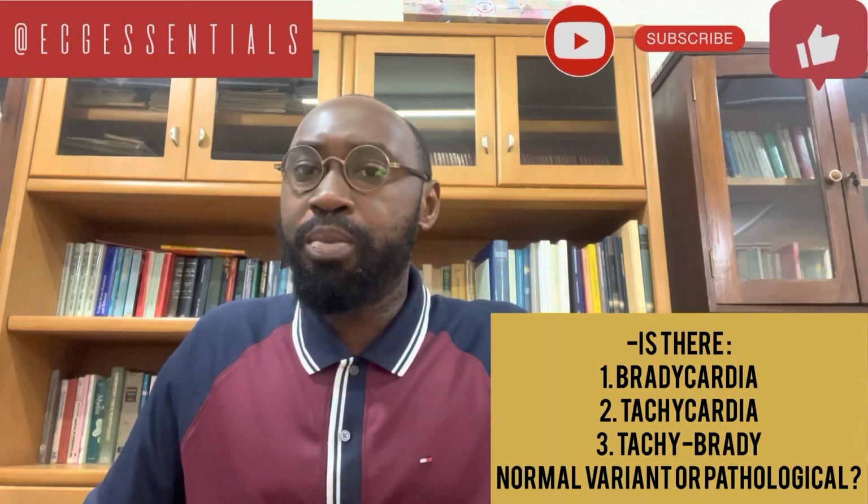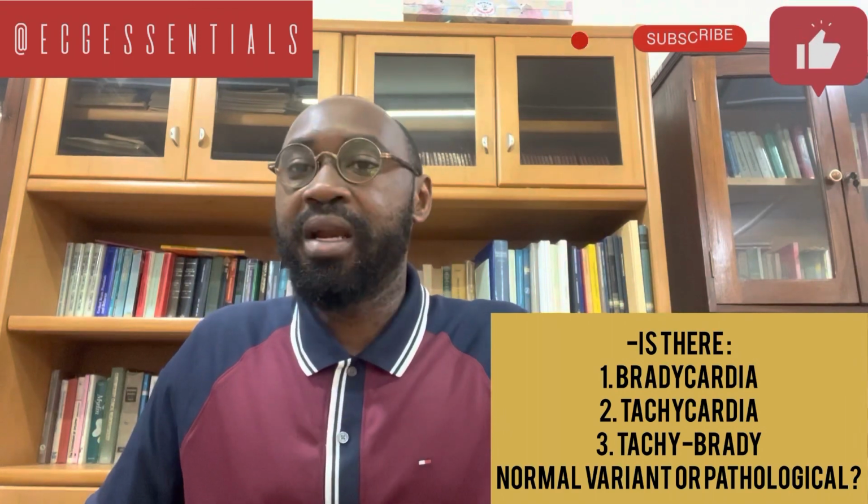So for the rates, you have looked at issues like bradycardia, and then you are thinking about possible causes. If there is a tachycardia, you are thinking about possible causes, or there also can be a brady-tachy syndrome, where the heart beats fast at a point, slows down at a point, which may be the case in sick sinus syndrome. And so these are some of the abnormalities that we still want to pay attention to when looking at the rate. With respect to the rhythm, that is the next thing that we are interested in.